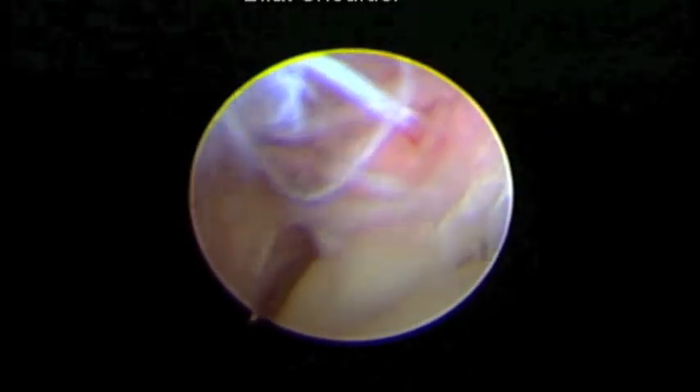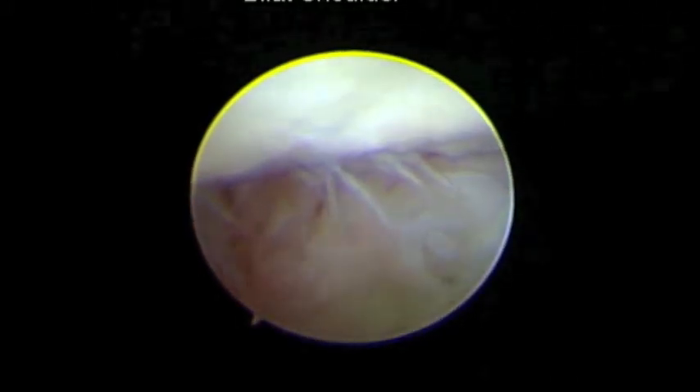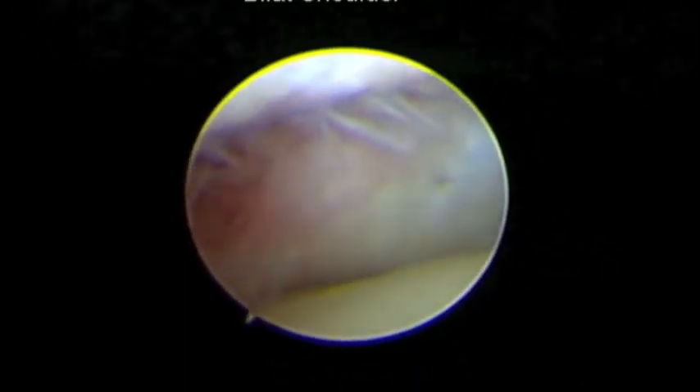There's your ligament again — gone. Your tendon — gone. Front portion of the ligament — gone. Working our way back to the capsule, we really shouldn't be able to see all those areas of the subscap because there's usually capsule and MGL there, but it's completely destroyed and disintegrated.